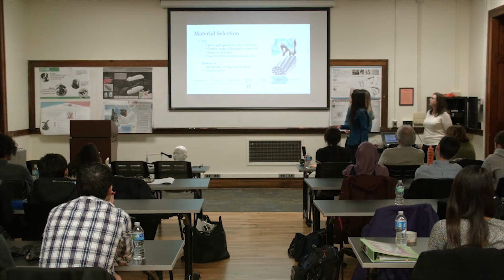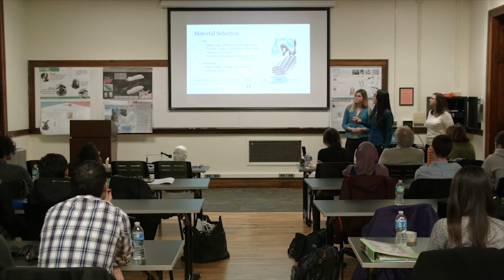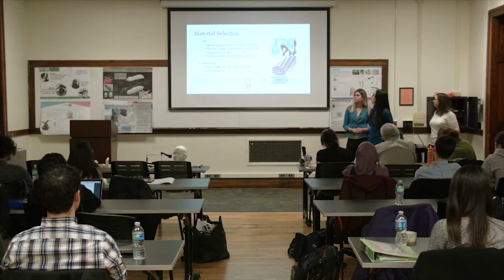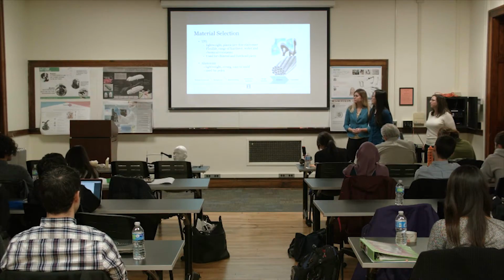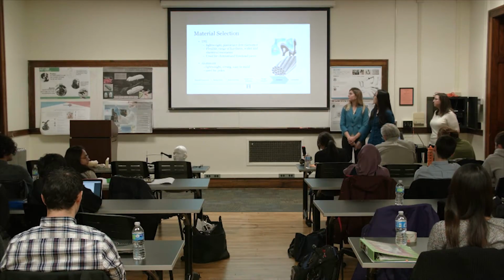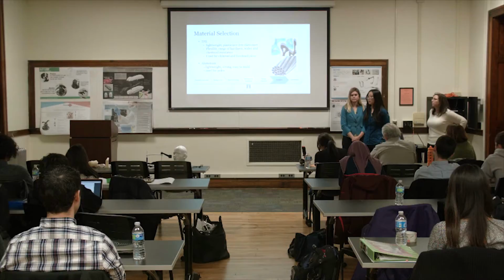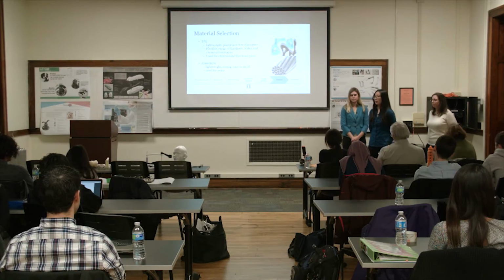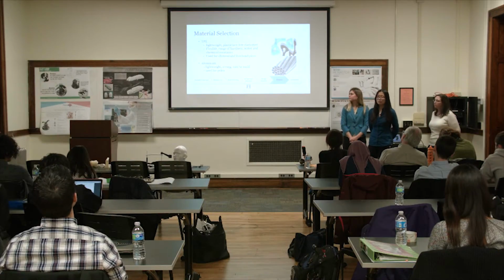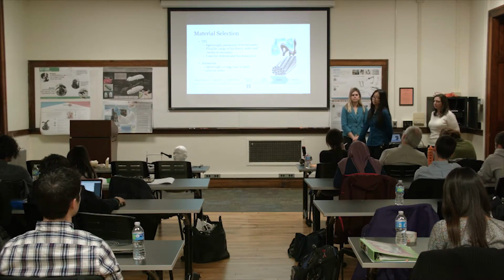We also selected the material for the forehead and chin rest and also the pole that connects those two. We chose TPE, which is thermoplastic elastomer, and it is pretty lightweight, so it won't add too much weight or stress on the stand that we designed. It is also water and chemical resistant, and the material can be easily manufactured by injection molding. And we use aluminum for the poles because it's also lightweight and a pretty strong material, and it is also easy to mold.